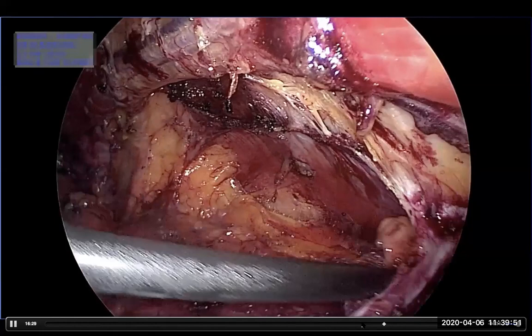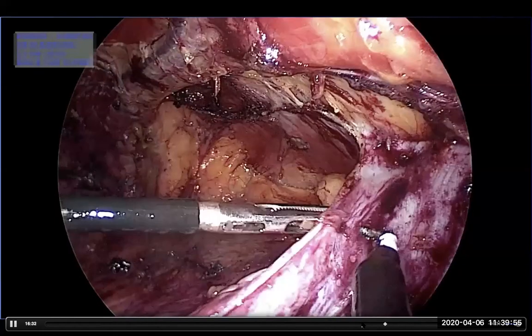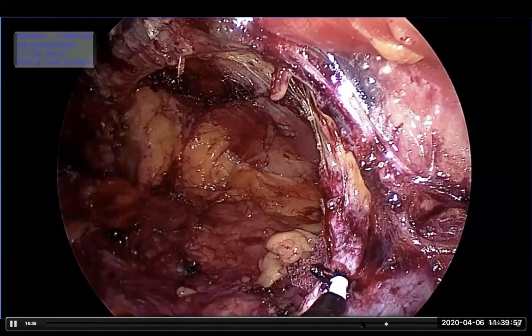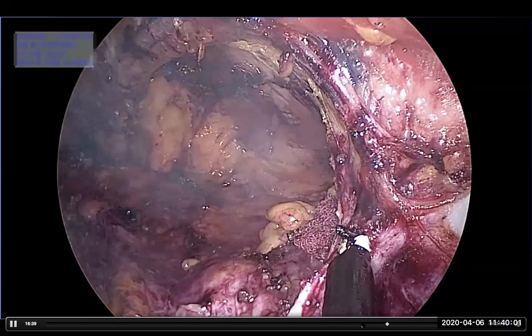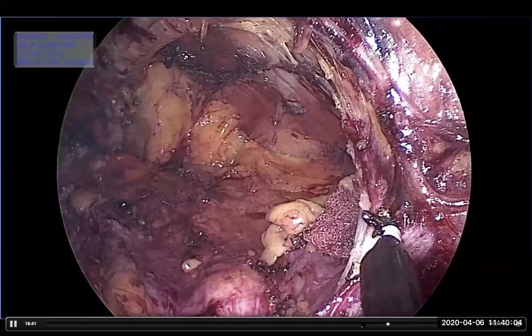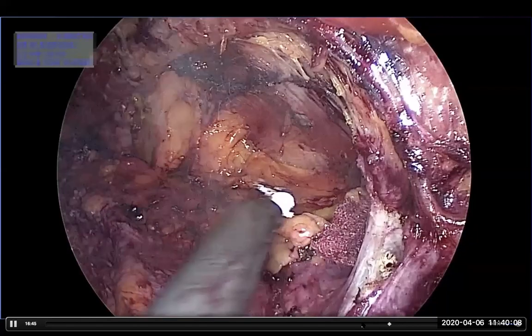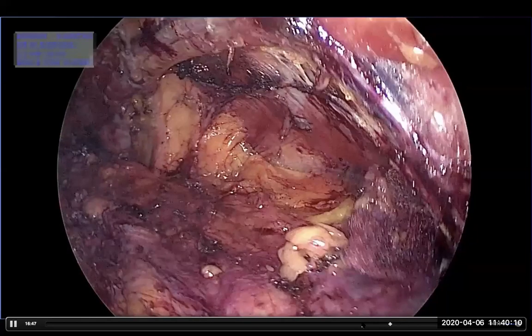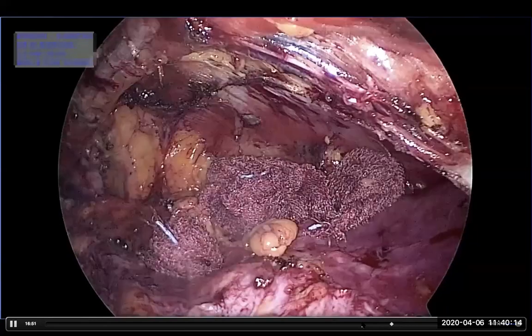And sometimes it may be difficult to do so. In an attempt to do so, you may actually end up opening the peritoneum, but try and be as precise as you can and don't be in a hurry. This step will bite you if you try to do it fast. And I would say go bit by bit and sweep that gauze piece, create that cave.